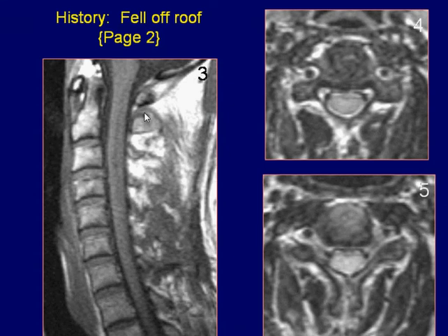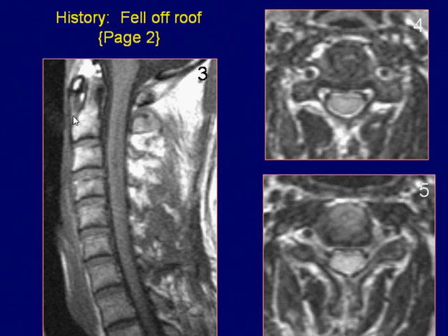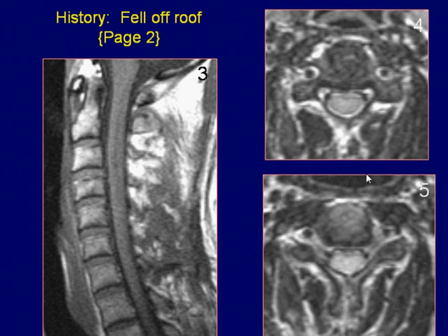Sagittal T1-weighted image demonstrates the spinal cord lesion as a subtle low signal intensity area. The pre-vertebral lesion appears heterogeneous with areas of mixed signal intensity. Axial T2-weighted images demonstrate a high signal intramedullary lesion with cord enlargement.